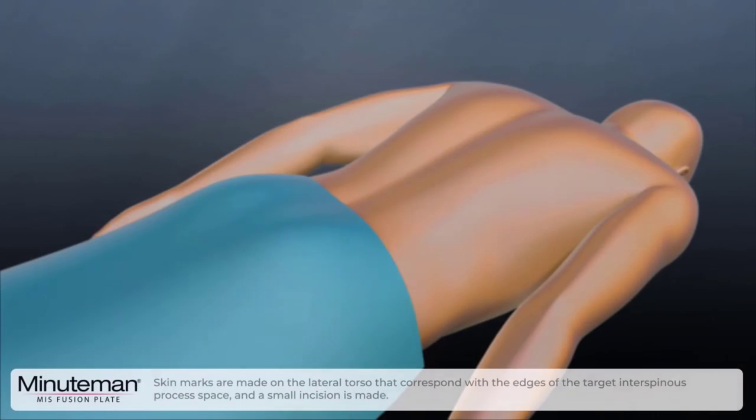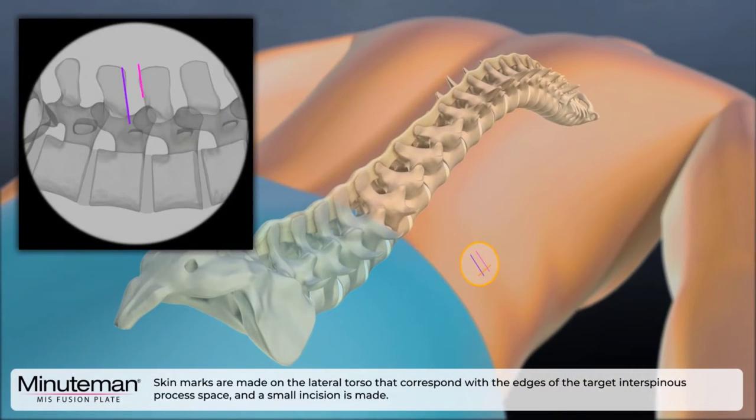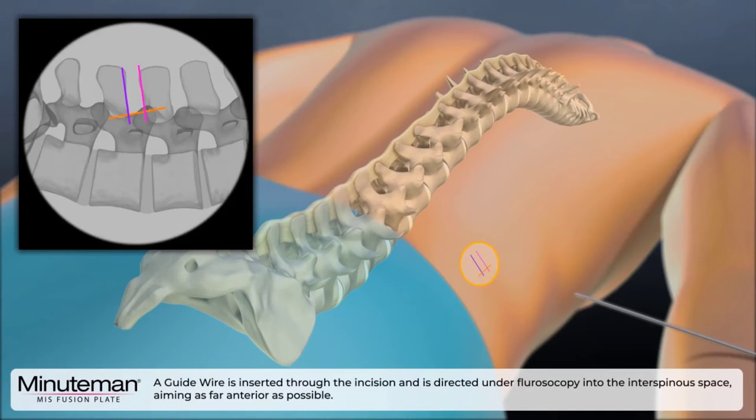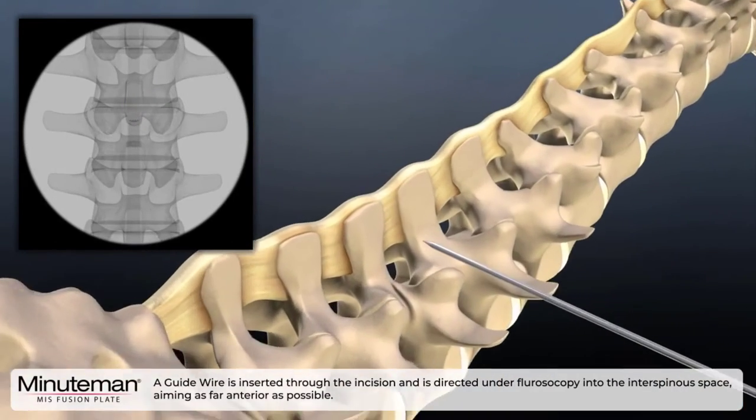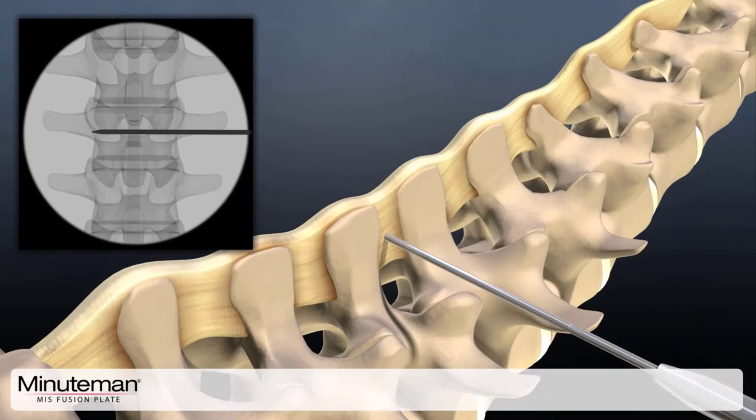Skin marks are made on the lateral torso that correspond with the edges of the target interspinous process space and a small incision is made. A guide wire is inserted through the incision and is directed under fluoroscopy into the interspinous space, aiming as far anterior as possible.